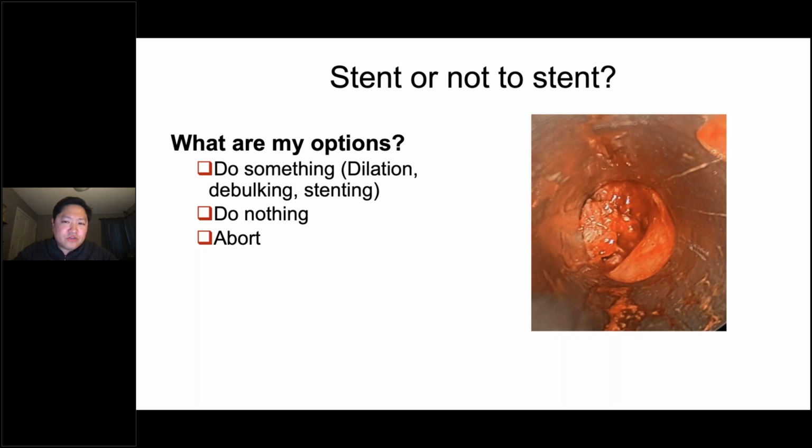So the question is to stent or not to stent. So your options during a procedure, and this is something I try to tell the fellows, your main goal and the reason why you bring this patient to the procedure room is to do something. But just because you have a mindset of doing something doesn't mean you need to do it. So if you're in there and you say, there's really nothing that we can do, you can do nothing. I think people are tempted to try to do something even if you're there. But you can decide on doing nothing, and that's fine as well.